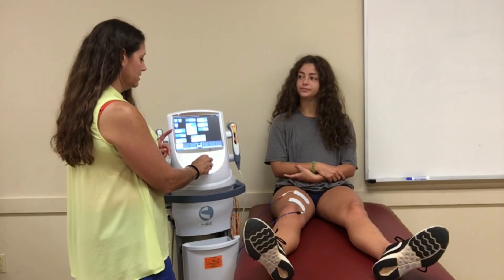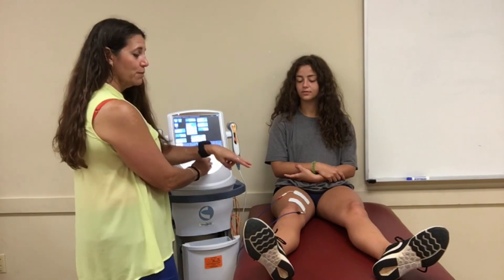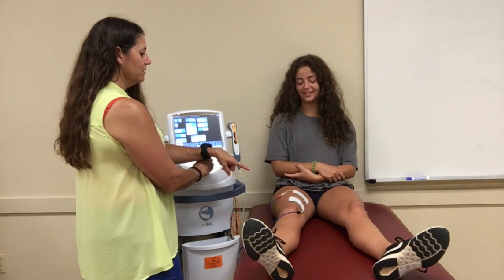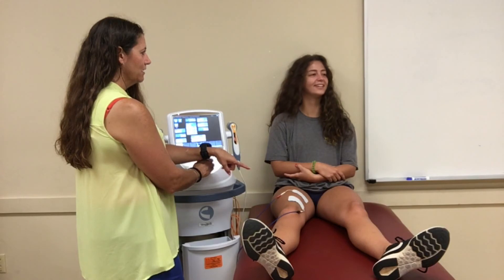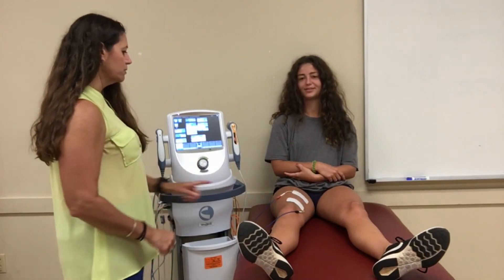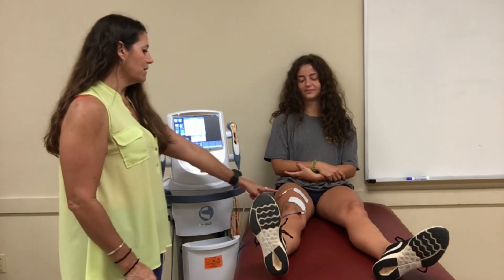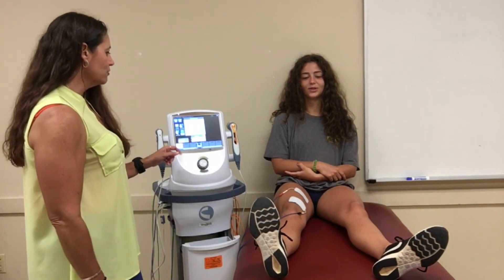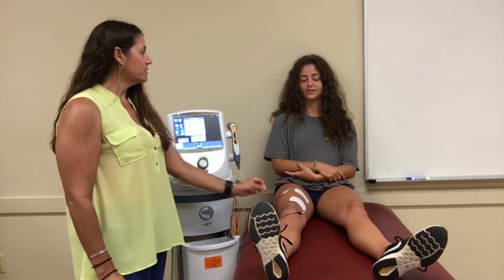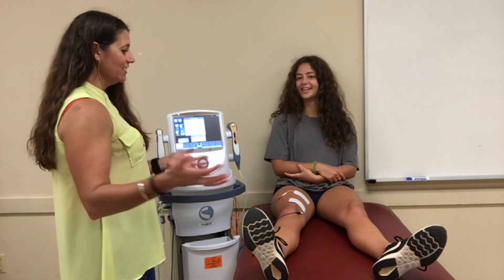Tell me when you start feeling it. It's starting to tingle. Then tell me when you start feeling a contraction. You should be able to see with your eyes as it starts — did everybody see that come in? So it should start squeezing. That's contracting right now. When she says that's enough, you say okay and hit start. Once it starts squeezing, squeeze with it — pull your foot up to get max contraction. Notice how well this muscle is squeezing. Then as it ramps down, she's still squeezing for two seconds, and once it's down completely she relaxes. Then 50 seconds later it does the same thing.